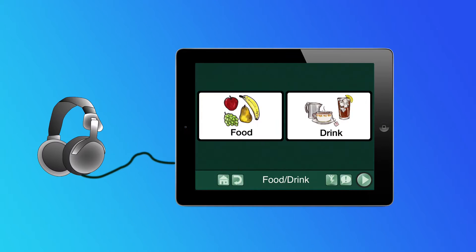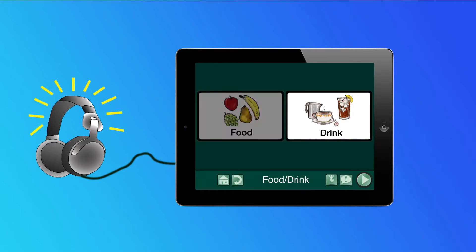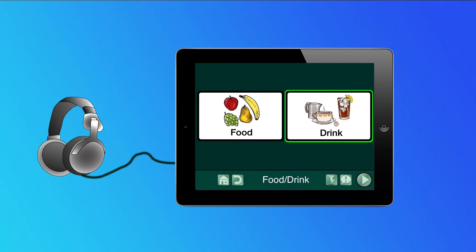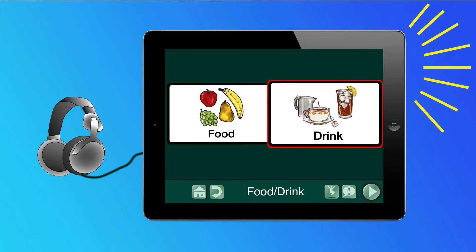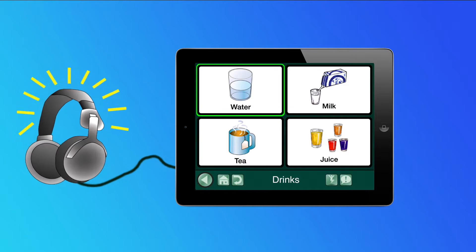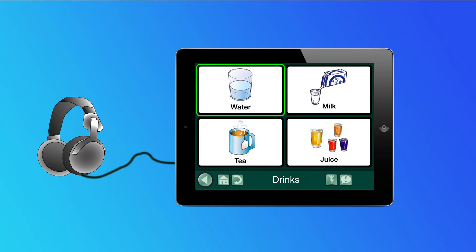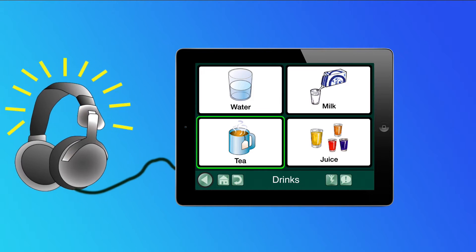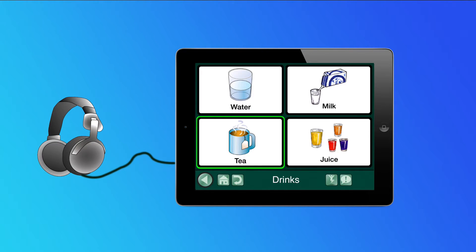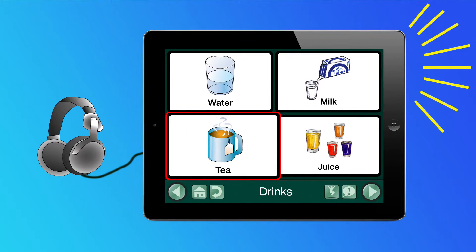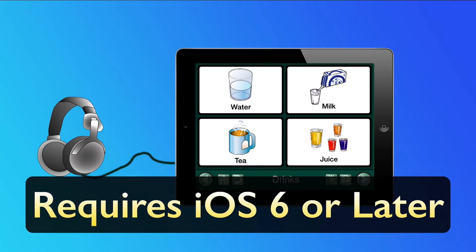Let's take a look. [Demo]: Food. Drink. I would like something to drink. Water. Milk. Tea. May I have some tea, please?